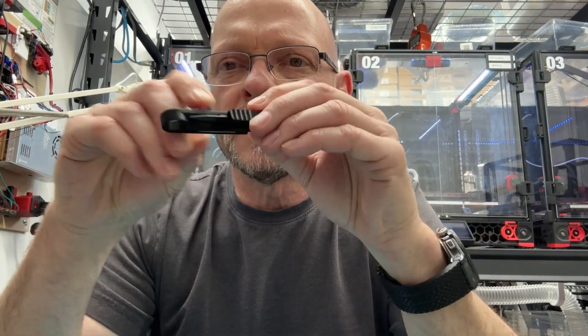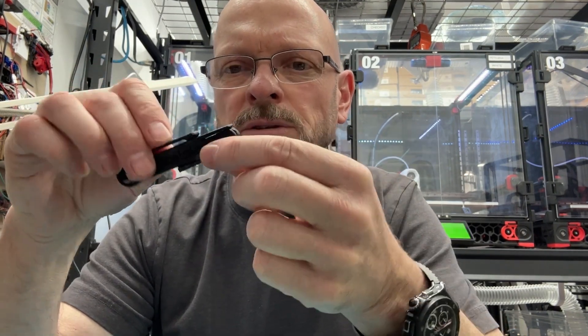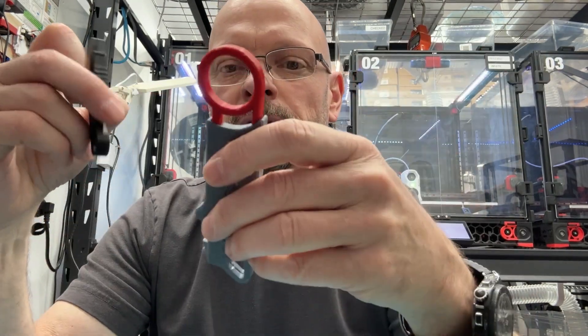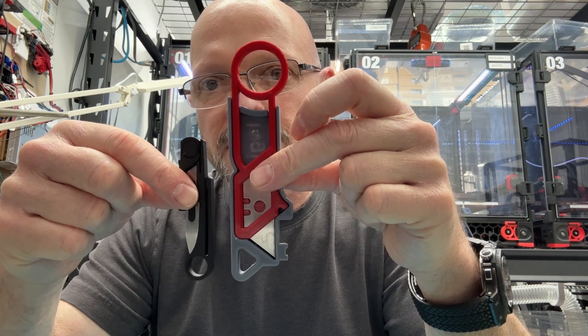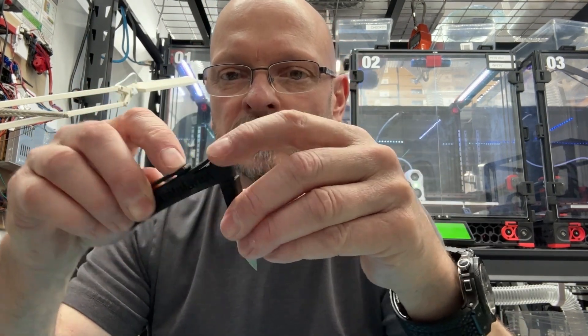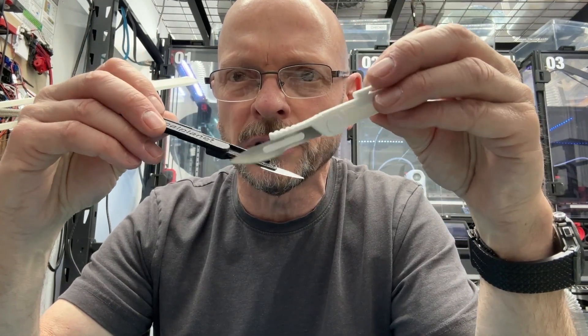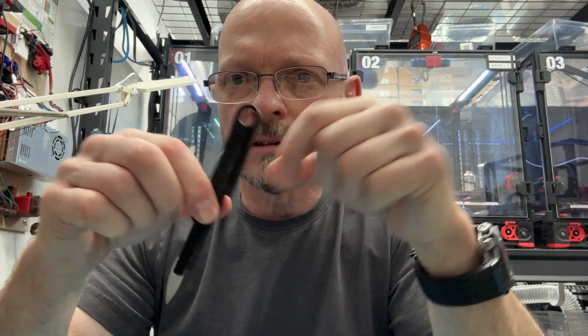Once it's folded up it stays folded — there's a little spring mechanism on the back which holds it in either position. You can see the size difference relative to a utility knife; the utility knife is not big but this thing's tiny. It's great for keeping handy in a first aid kit, in a pocket, or whatever. It's 100% print-in-place with no hardware, and I didn't find any folding scalpel like this out there.